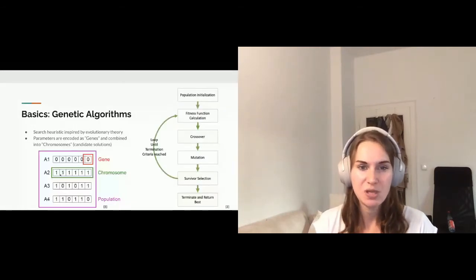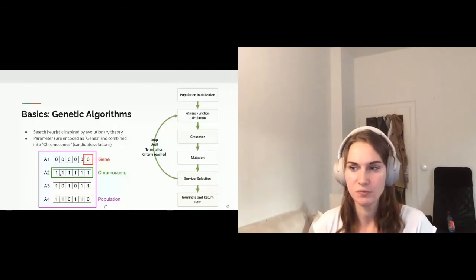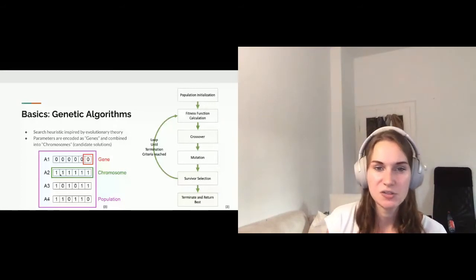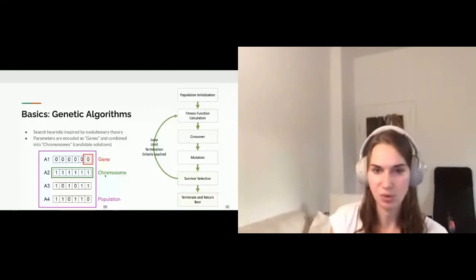So essentially what that means is each feature that one network candidate model contains is encoded as one of these genes. So for example, if you have a 3-layer network with 2 pooling layers or something like that, it doesn't have to be super specific, but essentially that will be encoded in these solutions together. So one chromosome is essentially one potential network solution that builds the population that you sample from. So each of these sequences represent a candidate model in our use case.